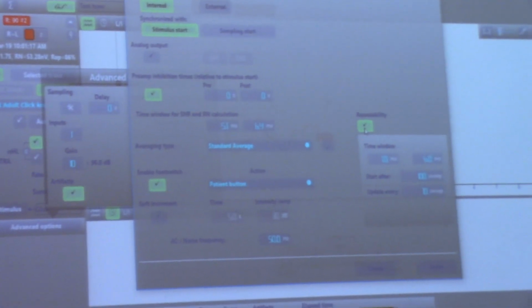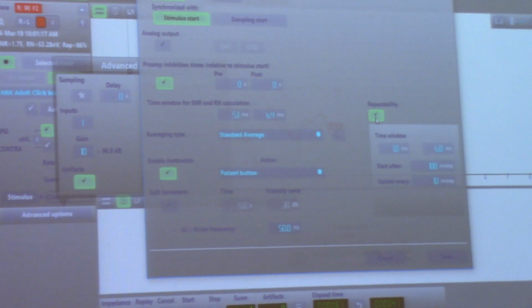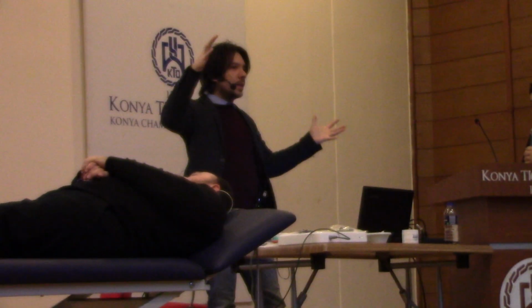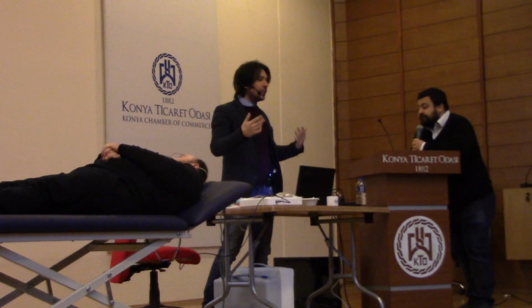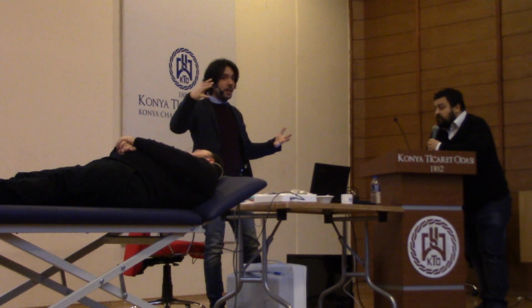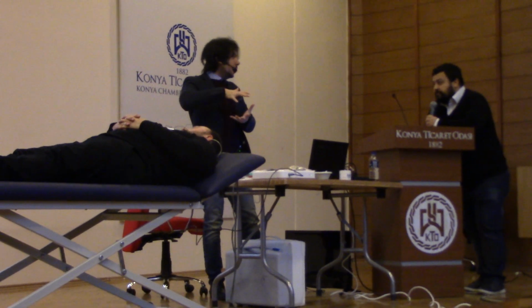Of course, it's better that the calculation, also in case of ABR automatic detection or signal to noise ratio, or all these parameters are calculated when the wave starts to be stable, not at the beginning where the noise is too much and averaging is going, but the noise is still higher. So it will be more accurate after a while.